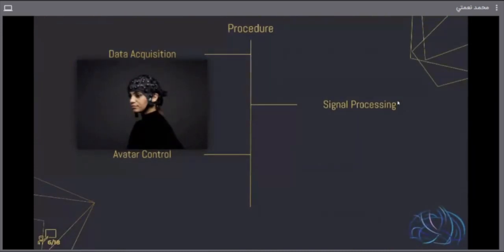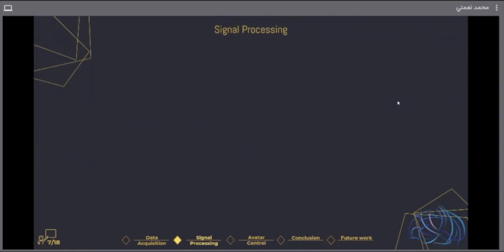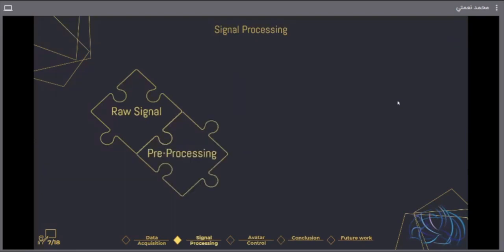After recording the raw signals, we go to the next step, signal processing to interpret the command signals. We can break down the signal processing procedure into 4 steps. The input is the raw signal we collected in the last part. EEG signal is very susceptible to noise. We implemented a head holder and a Faraday cage to avoid some of them happening. However, many noise sources still affect the signal and reduce the signal to noise ratio.